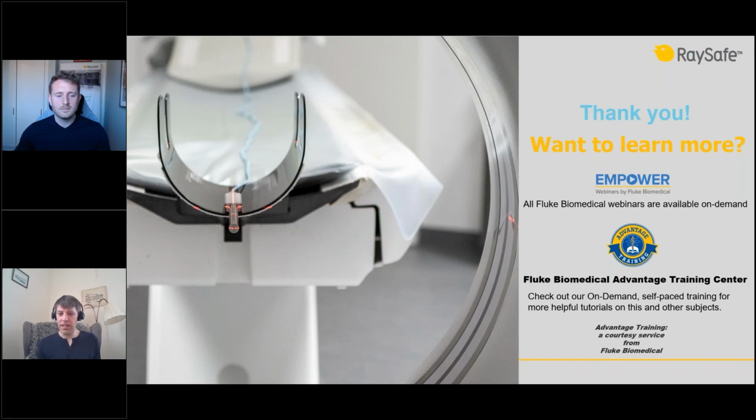However, I can't answer that question on the fly. It's quite easy to calculate. There is a program called SpecCalc that I use that is free for academic use, which you can find when you Google it, where you can enter your filtration and your kV, and the distance you have from the X-ray tube.